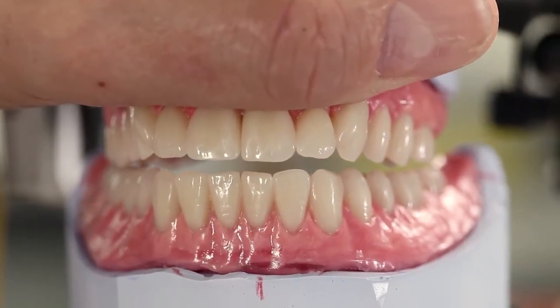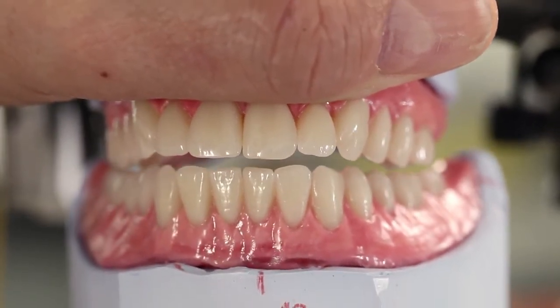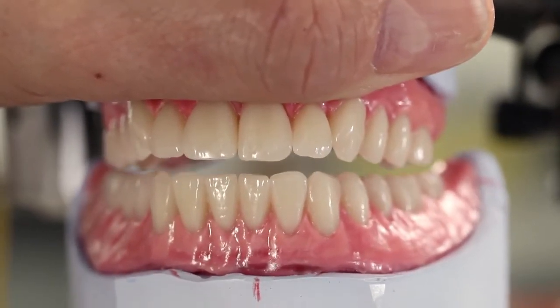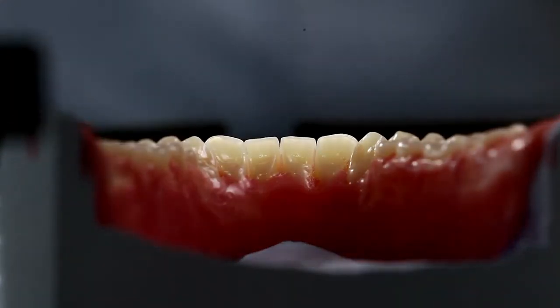Set up or grind in the anterior teeth in such a way that they come into group contact with the posterior teeth. Premature contacts must be avoided. Prevent a mere anterior and canine guidance in any case.